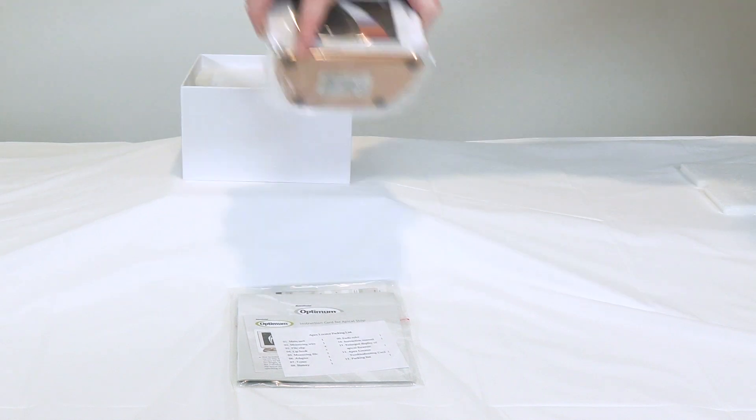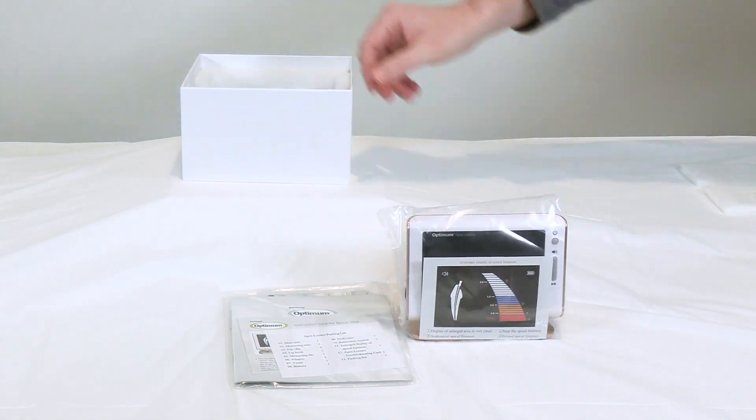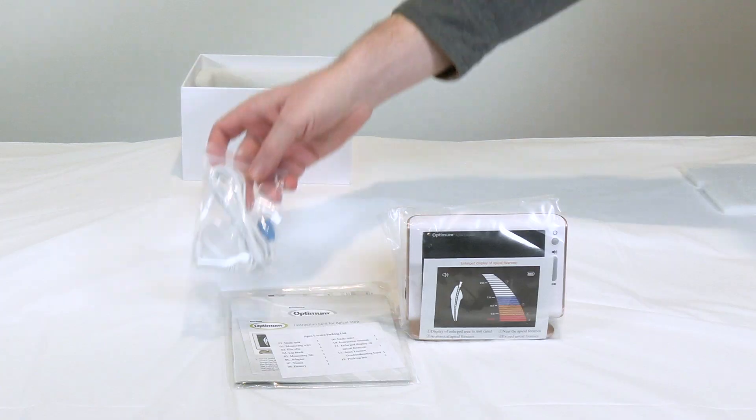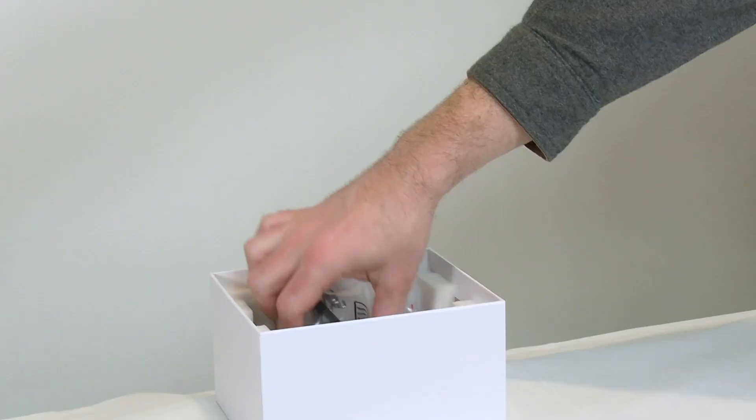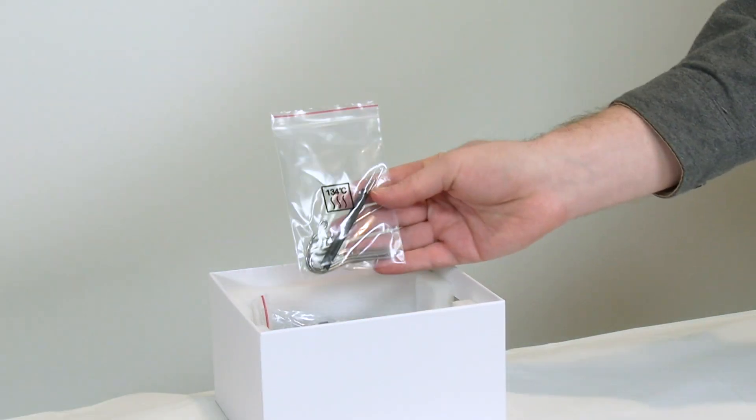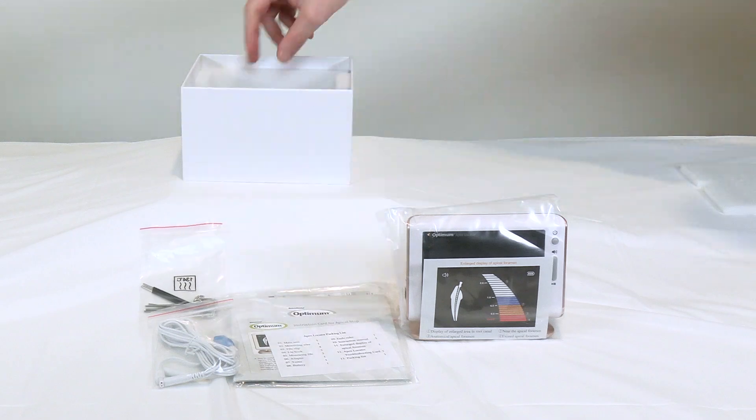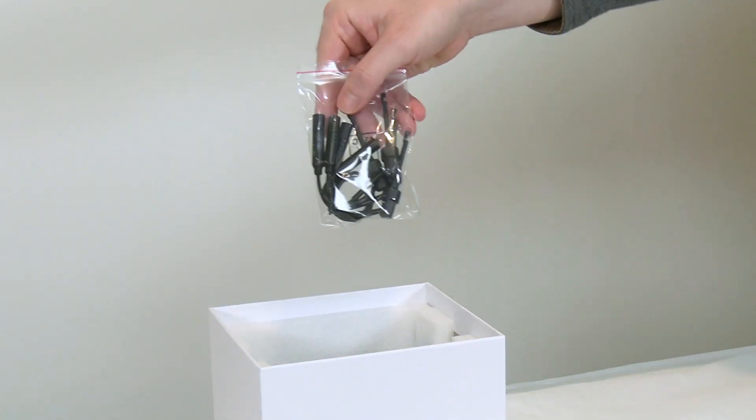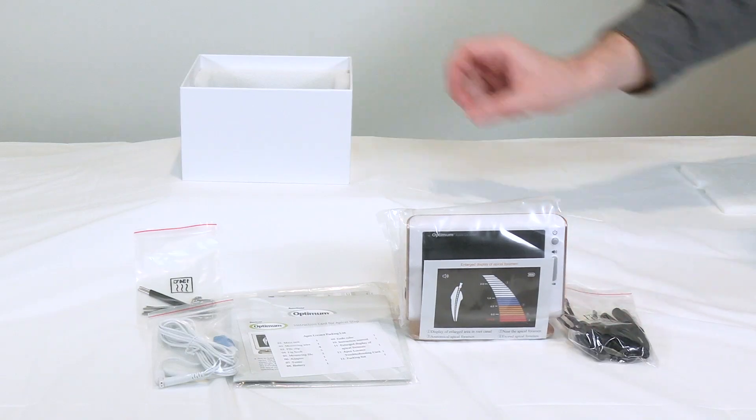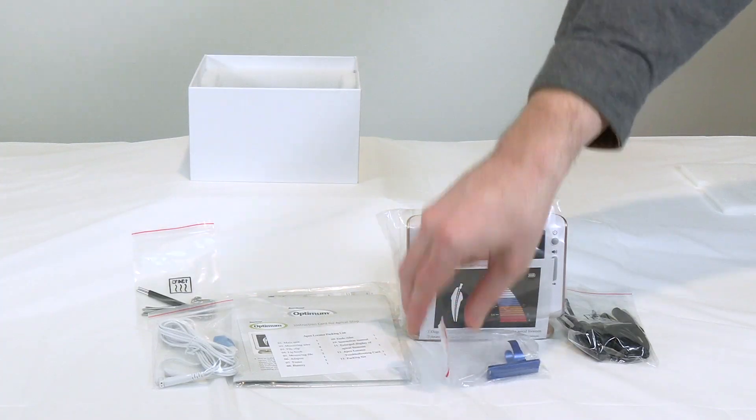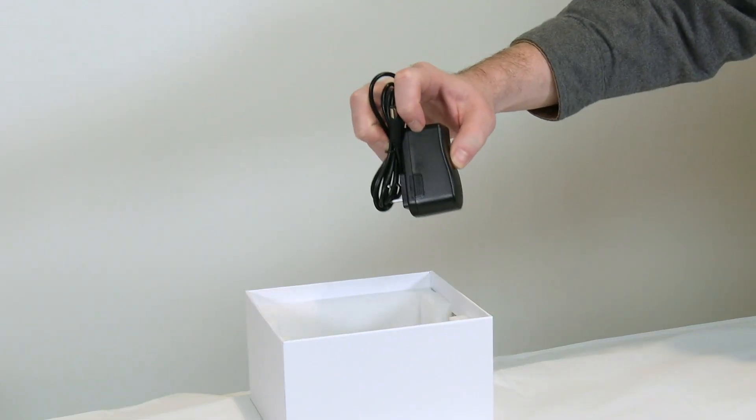The main unit, a bag containing the measuring wire and tester, a bag containing multiple touch probes and lip hooks, a bag containing multiple file clips, an endo ruler, and a power adapter.